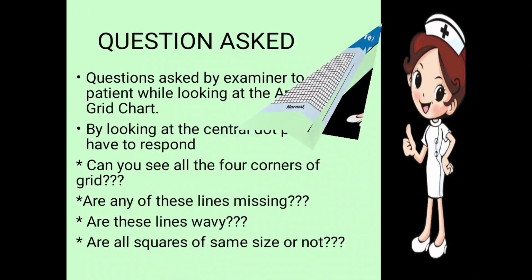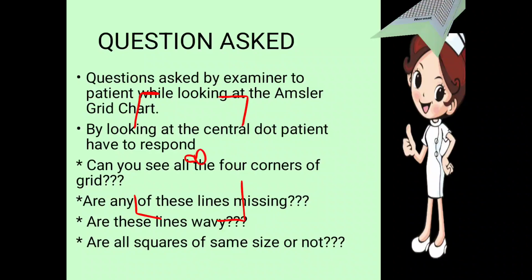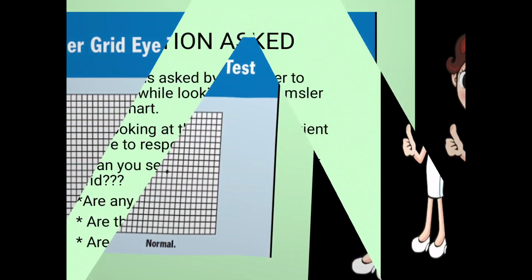Next one, are any of these lines missing? We'll ask the patient, is any of these lines missing? There are a lot of lines. Ask the patient whether any of these lines are missing or not.